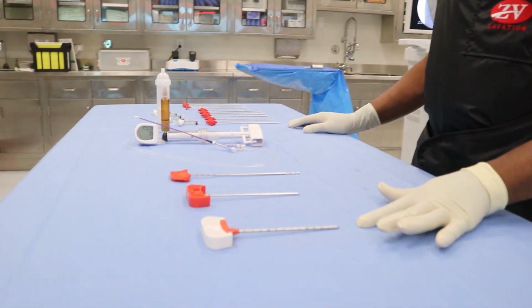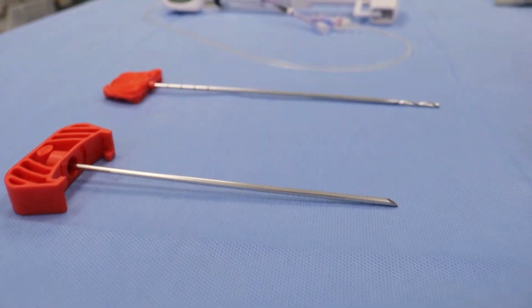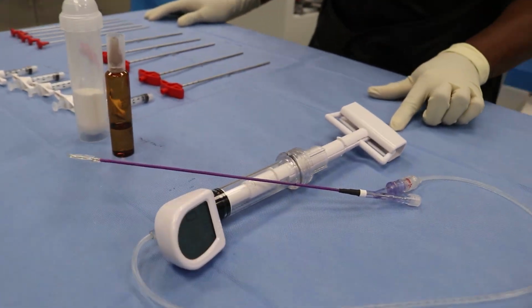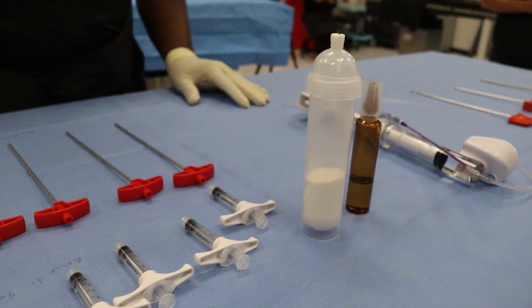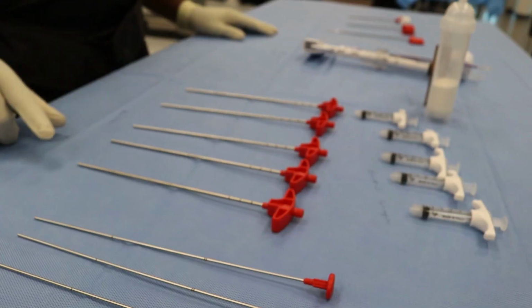This is the Jamshidi with a diamond tip. This is a bevel tip. This is a drill. This is the inflation balloon for the system. This is a two-component OsteoFlex cement. This is the bone-filling syringes, and this is the bone filler.